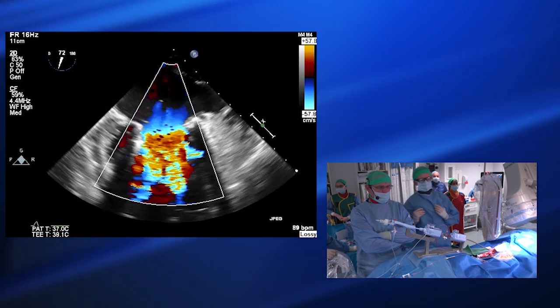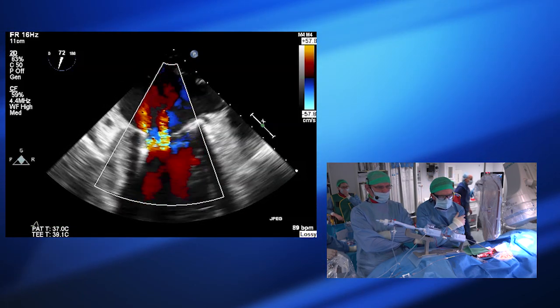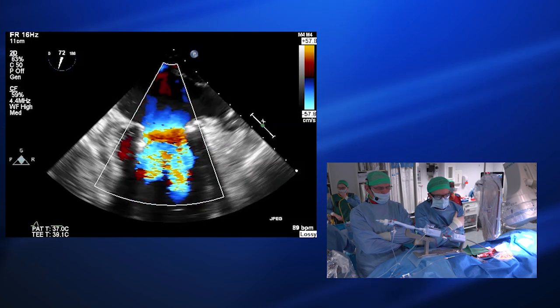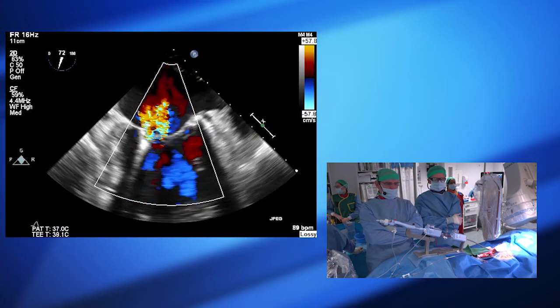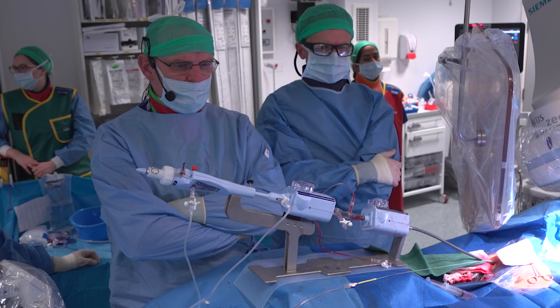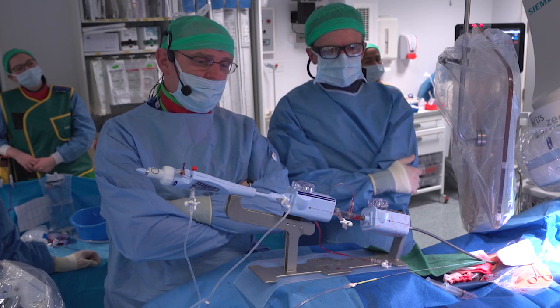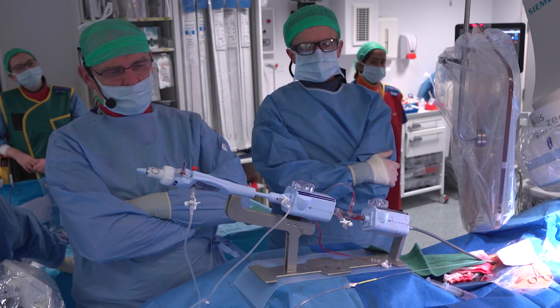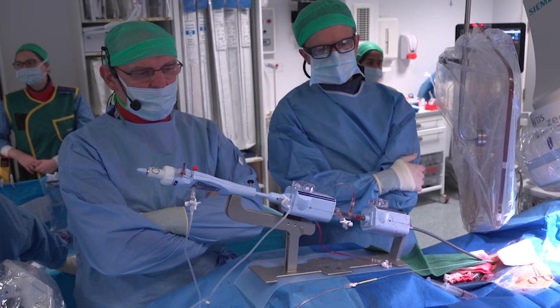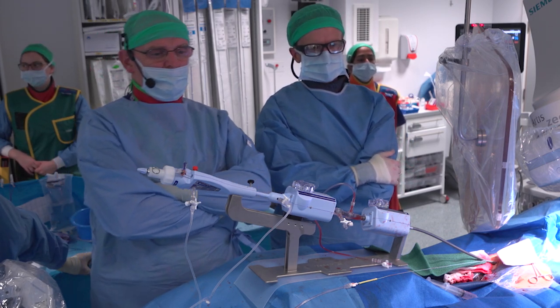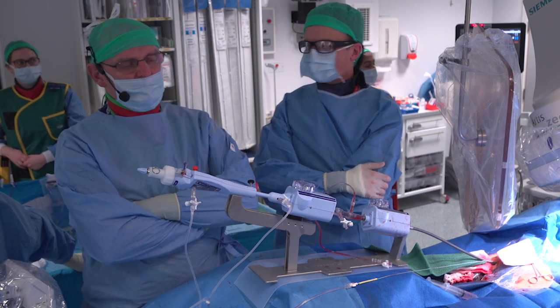So far this is looking pretty promising. We have very little left on the medial side and a residual lateral jet which we're planning to fix. The lateral jet is a little separate from the first clip, so it would be a bit more tricky to treat. If the clips are close together, you can get very close with the other clip and it won't have much impact on gradient. If they're far apart, you risk leaving a jet between the clips that you can't reach, and also pushing up the gradient — you end up with a three-hole orifice which is not very big. The gradient tends not to change very much between clip one and two.